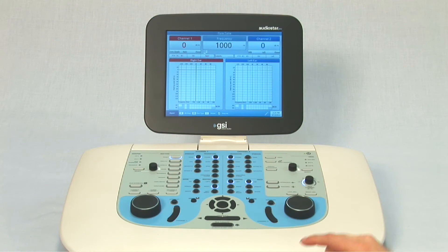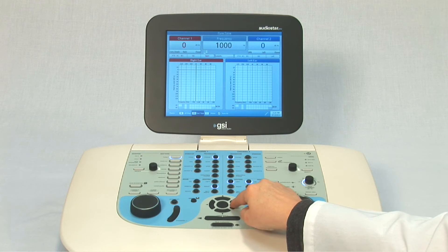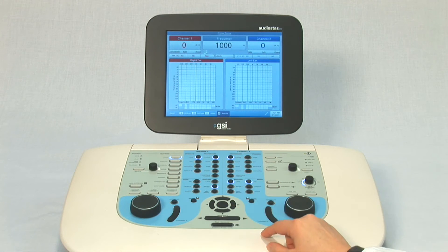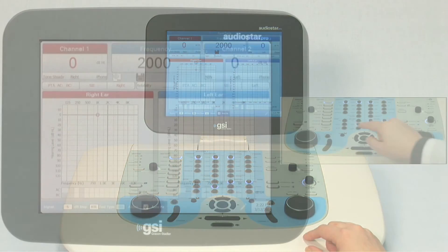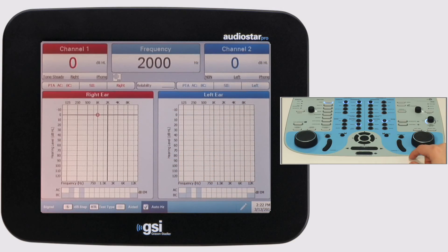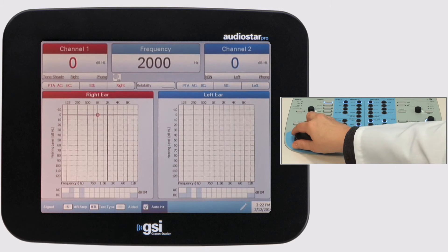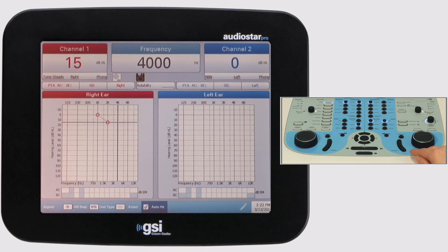On the device, make sure the Autohertz box is checked in the toolbar. Store a threshold at 1000Hz and note that the AudioStar Pro automatically shifts to 2000Hz, the next frequency in the list. Store a threshold at 2000Hz and note that the AudioStar Pro automatically shifts to 4000Hz, and so on until testing is complete.